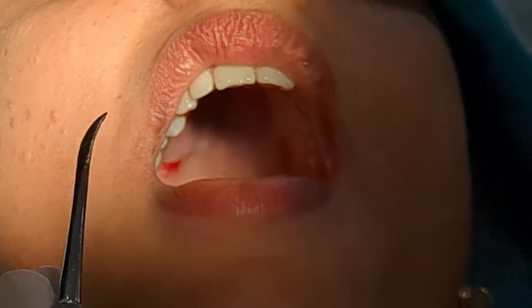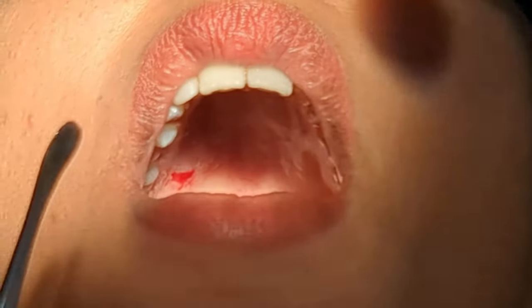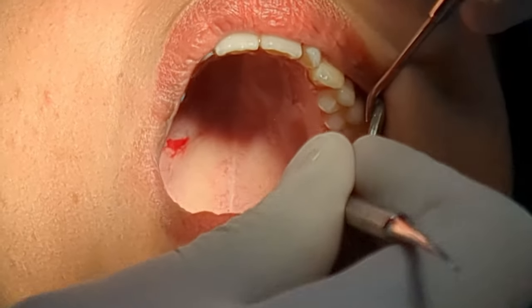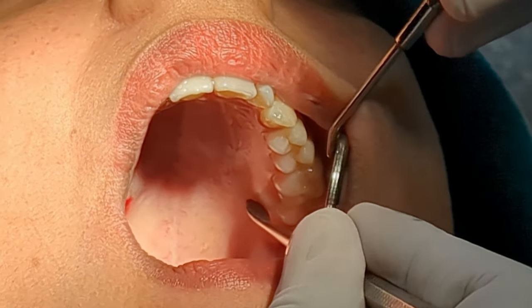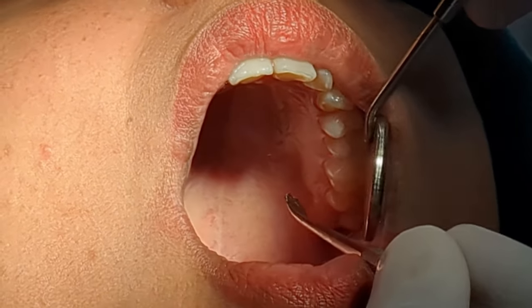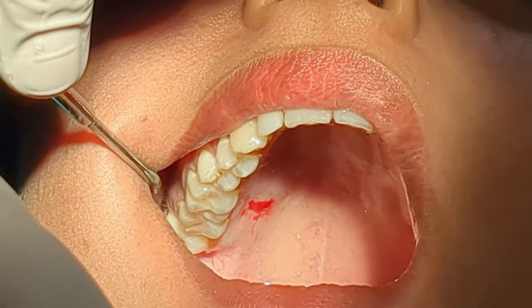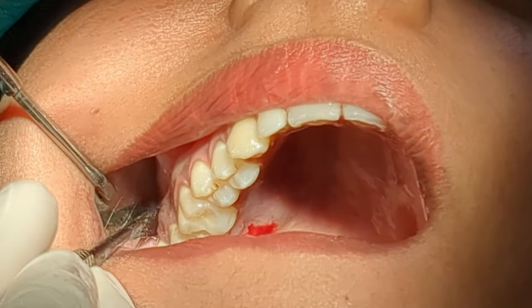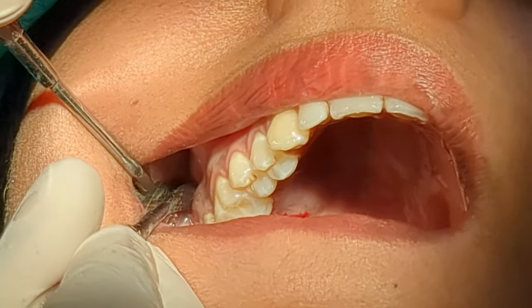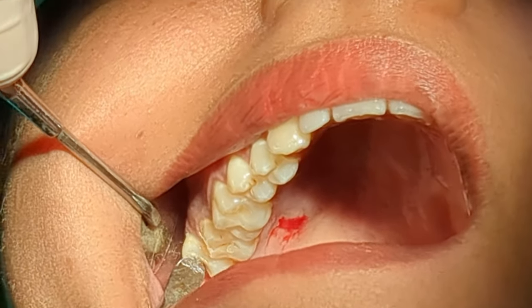I am going to check for the symptoms of a successful nerve block — PSA and greater palatine. I am going to show the patient first what actual pain is, so the patient will be able to differentiate between pain and pressure. I have given the LA for the extraction of this tooth — this is a partially erupted maxillary right 3rd molar.